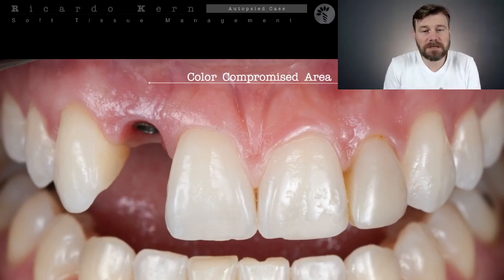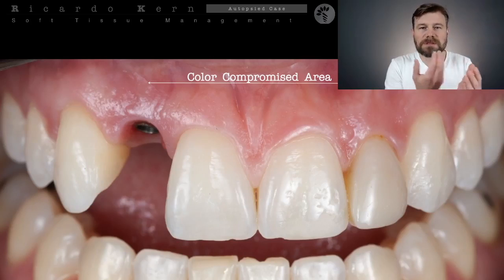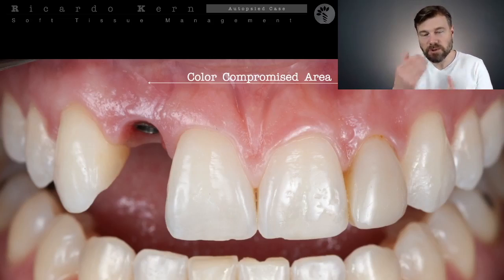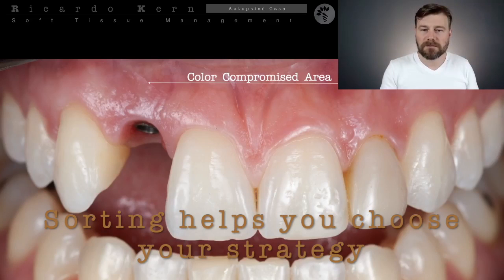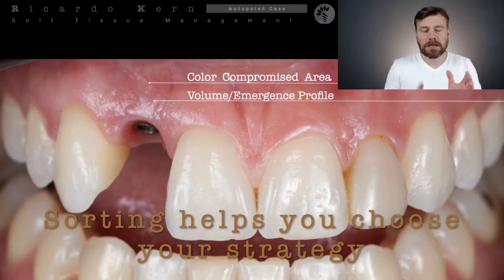Sometimes the abutment itself is the problem. And the gray area, by translucency, we can notice this difference in the color of the implant on the surface. So we need to increase the thickness of the soft tissue to block and avoid this difference of color.